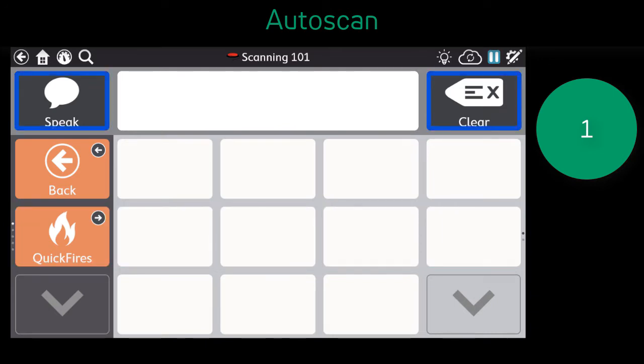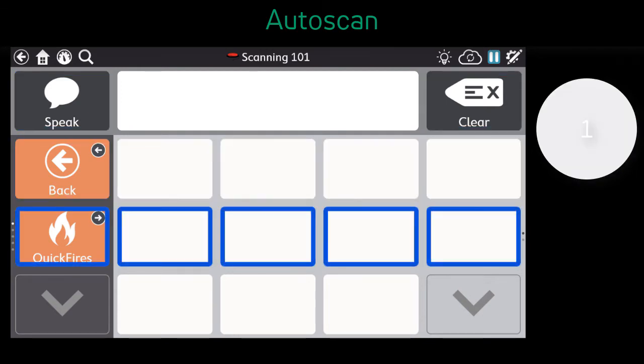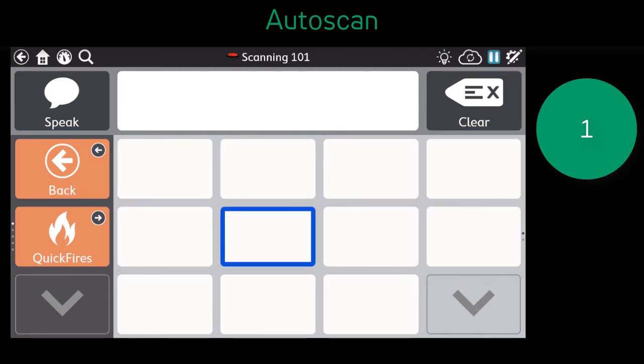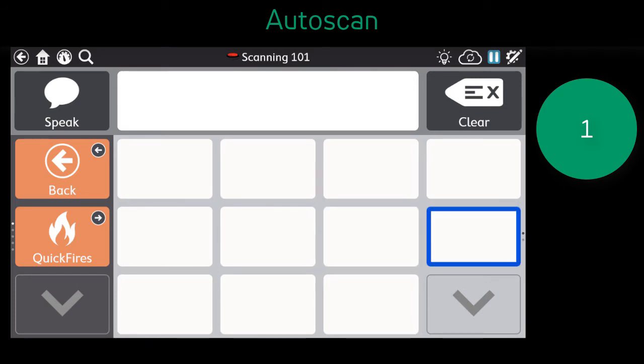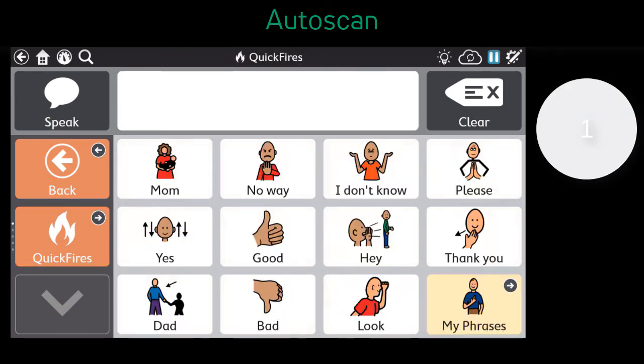The speed of the scan, as well as the transition time, are set to a specific amount and can be adjusted within the setting options to meet the needs of the user.